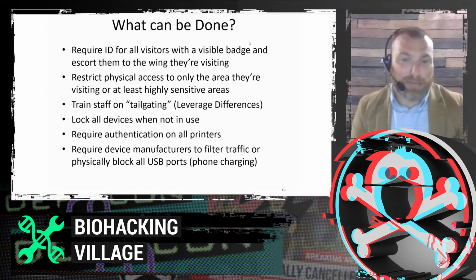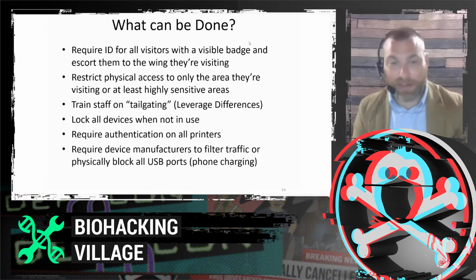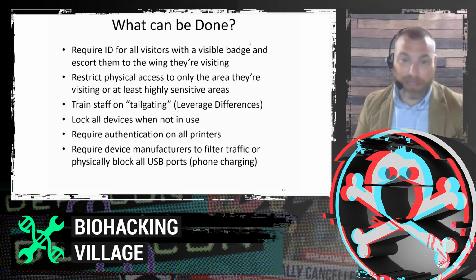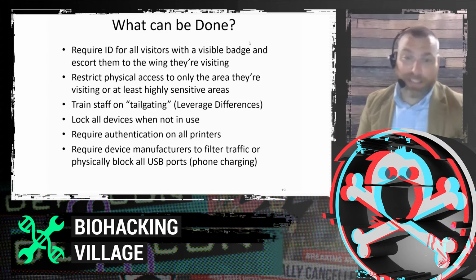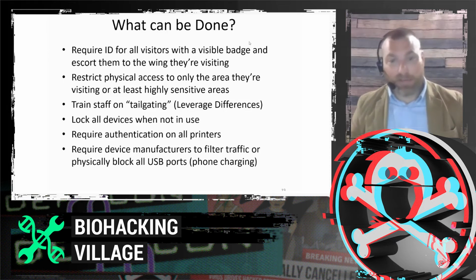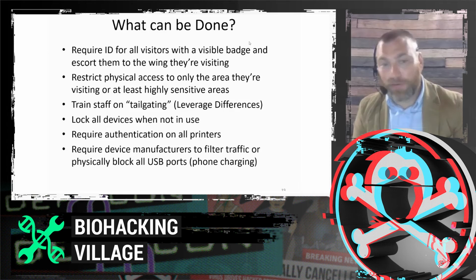useful. Again, going back to that application support staff at a hospital: if your staff's not getting paid over the weekend to be on call and they regularly get calls at 11 at night during shift change, you're basically incentivizing them to open access up more than it should be so that they don't get that call. So definitely try to avoid that.